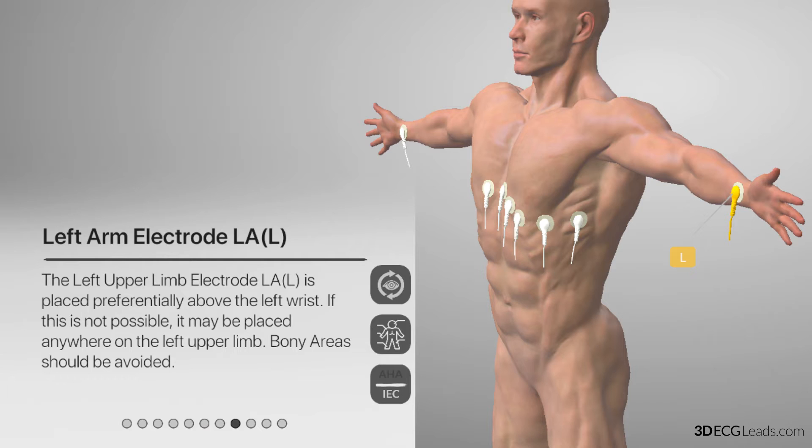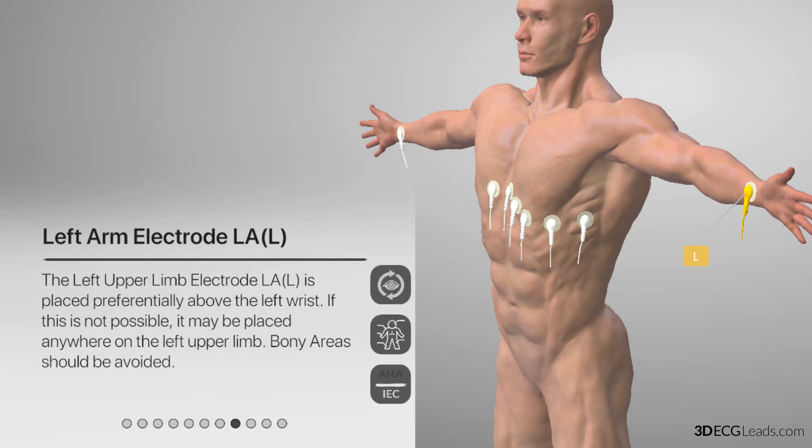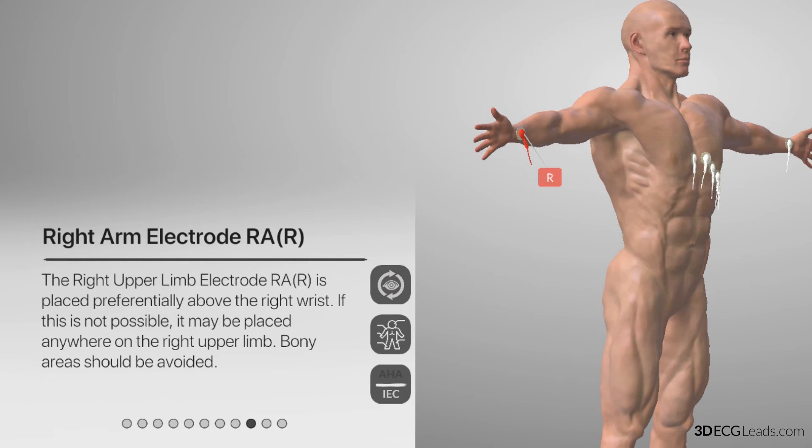Now you will find the left arm lead is named L, and is yellow in color, instead of black. The right arm lead is named R, and is red in color, instead of white.